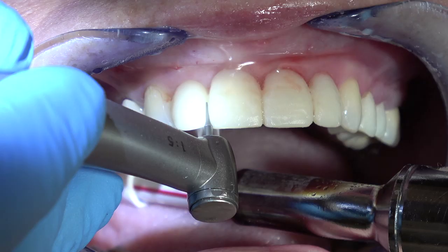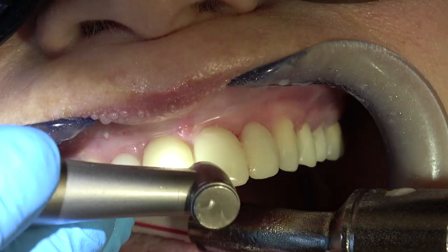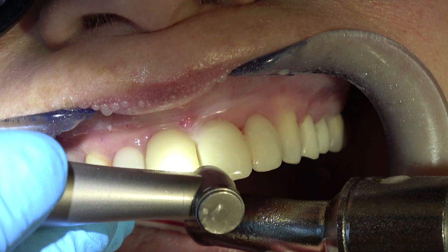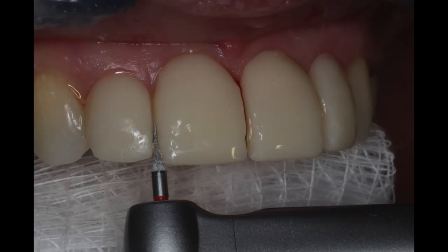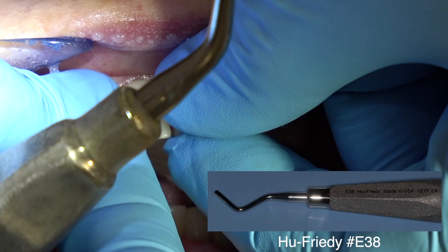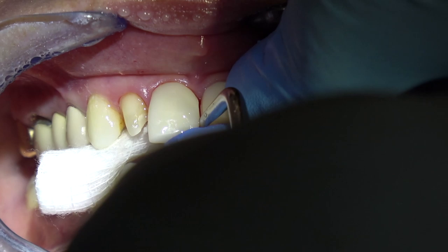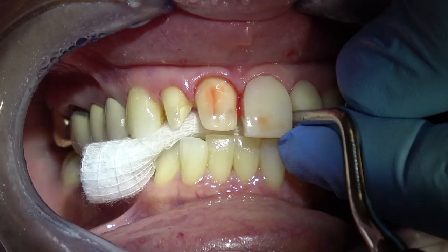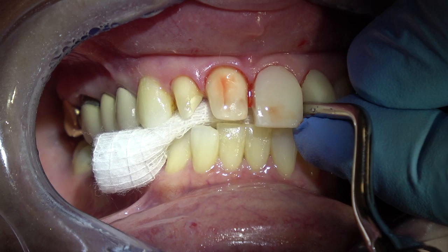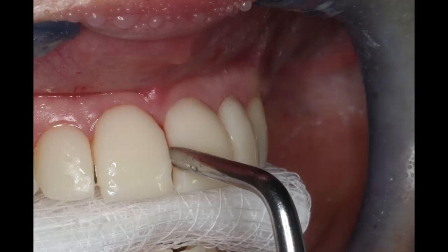All right, then we are going to remove the four provisional bisacrylate restorations with this mosquito diamond and just cut between each of the provisional veneers. Then we're going to torque them with this elevator. Now this is a Hu-Friedy E38, and what I've done, I've taken it into the lab and cut it flat where it doesn't have an elevator surface. It's a flat surface, and you can put this between the restorations and just torque them and they'll pop right off.